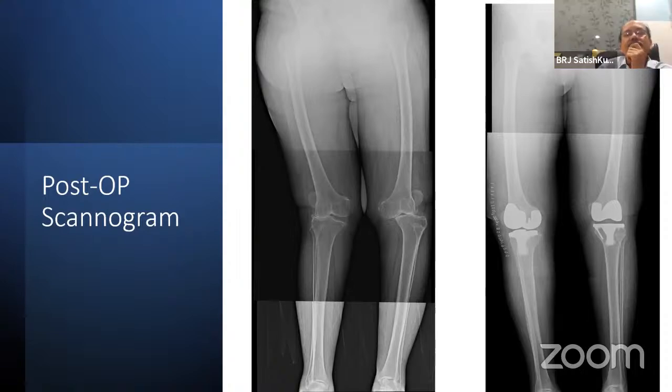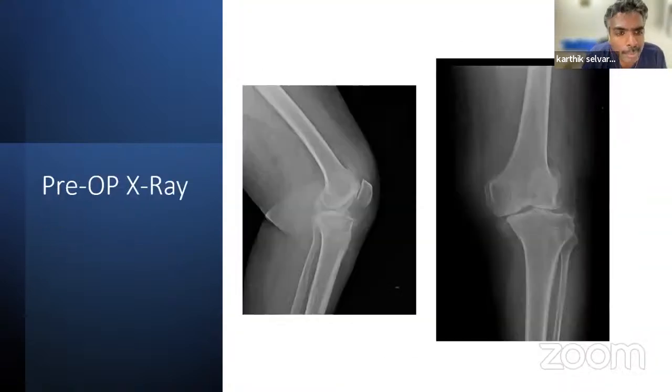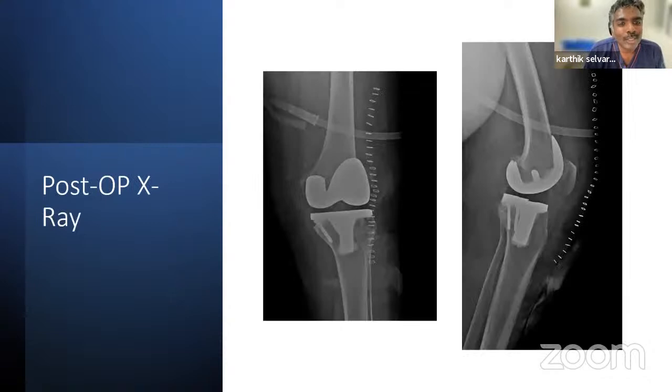This patient had a significant medial defect. We did a lateral parapatellar approach for the right knee, since it's a windswept deformity. Here I just used a screw and cement. This is described, but I generally don't do this. I think I put a graft, I'm not even sure. It was about 3 months back. I think I put a graft and a couple of screws.